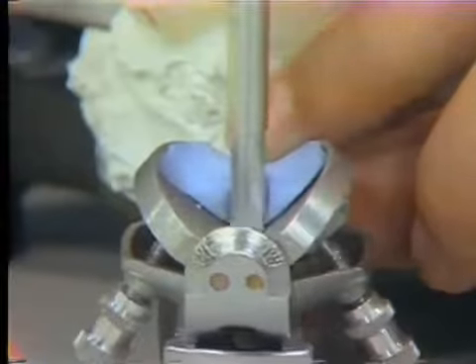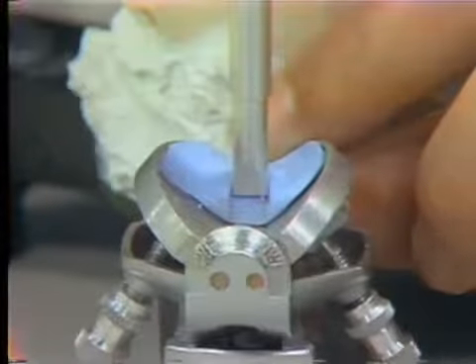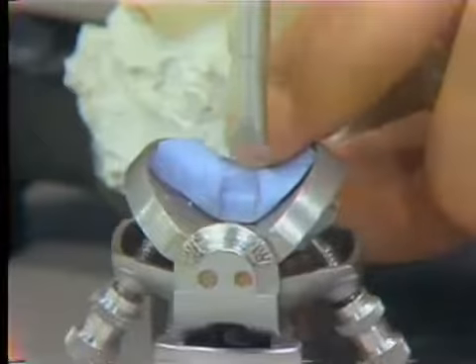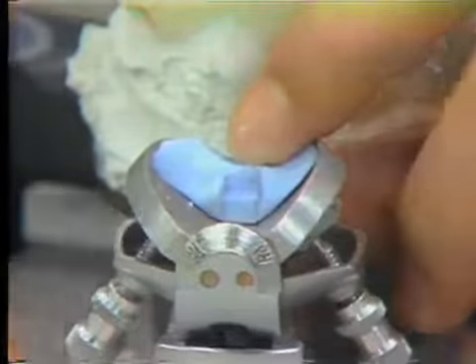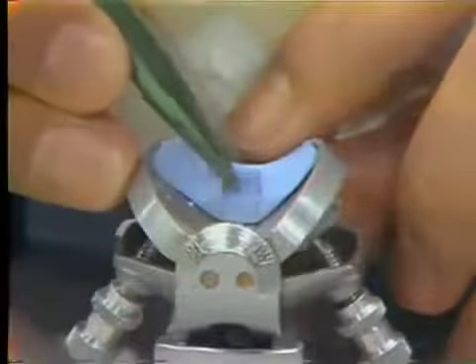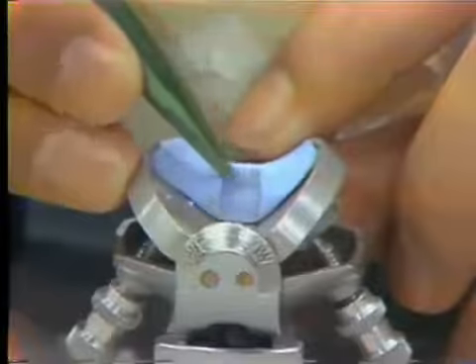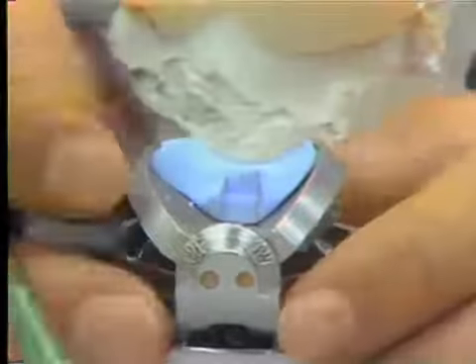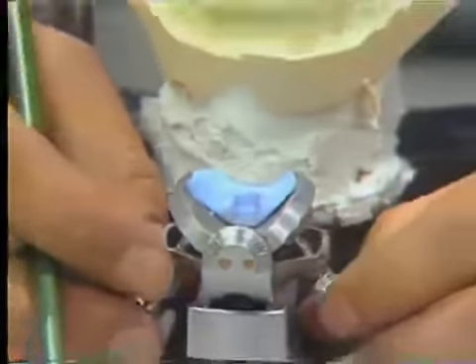So we're not protecting the incisal edges at this relationship. So this we can cut back, or we will reduce. We reduce the level of this acrylic to this little plateau area. We will have to do this with a dental burr or an acrylic stone.